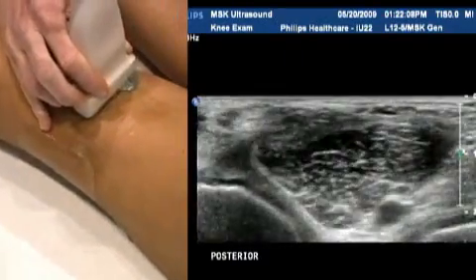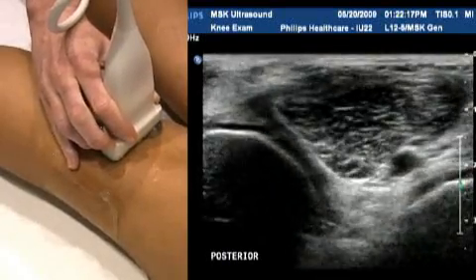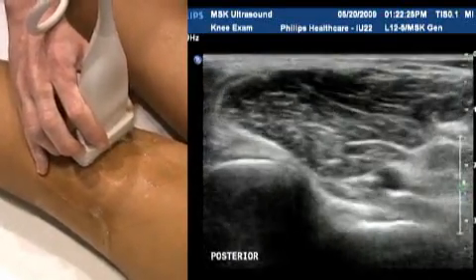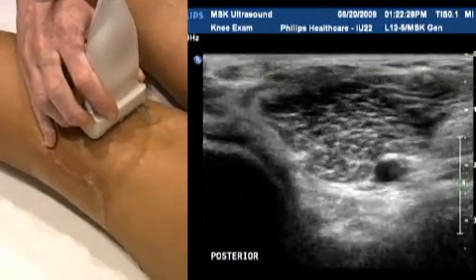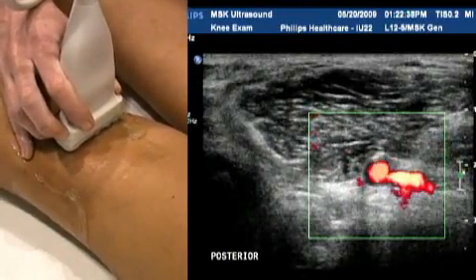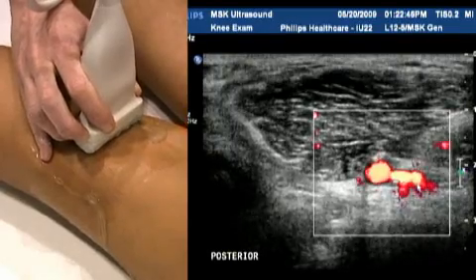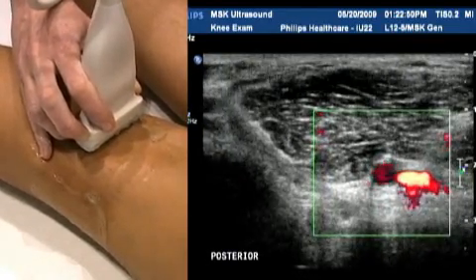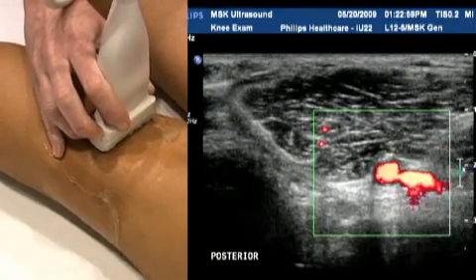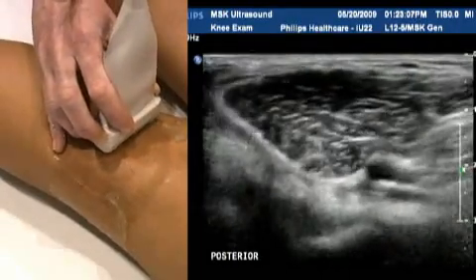Posteriorly now, the tibia and fibula are the deep structures you see. You can see the popliteal artery pulsing away. As a corollary to your study, it's a good idea to scan through that portion of the popliteal artery using colour Doppler or power Doppler — you can see the artery pulsing and the vein next door. You can assess the popliteal artery for aneurysm and plaque, and the vein for thrombosis, making sure it's easily compressible as part of a deep venous thrombosis study.